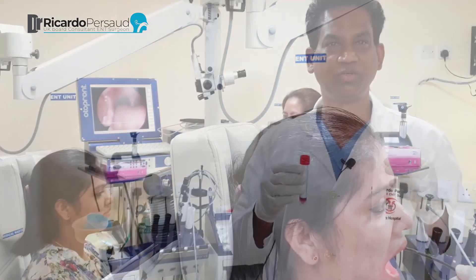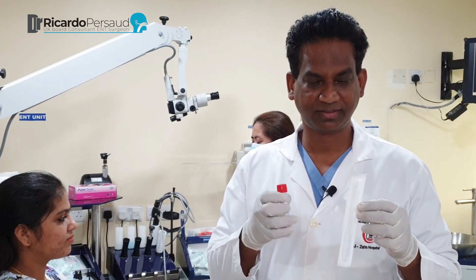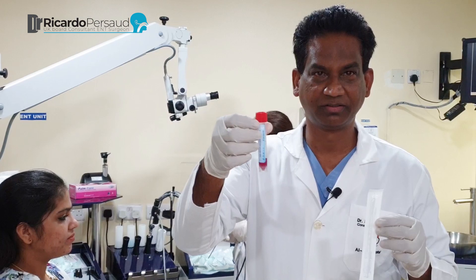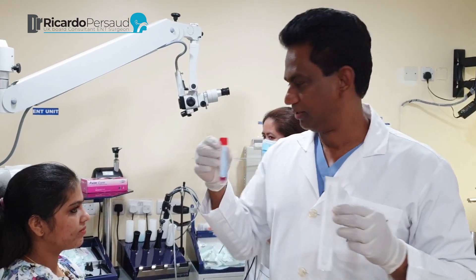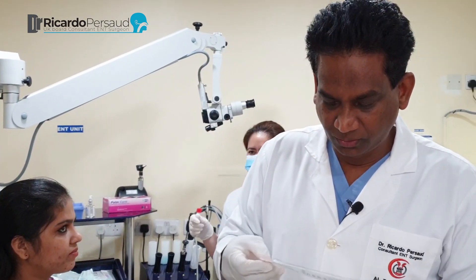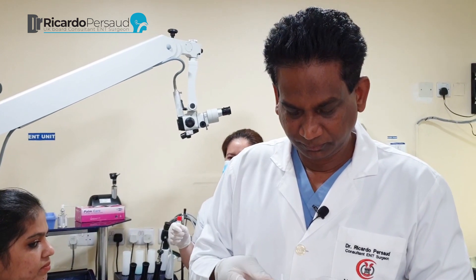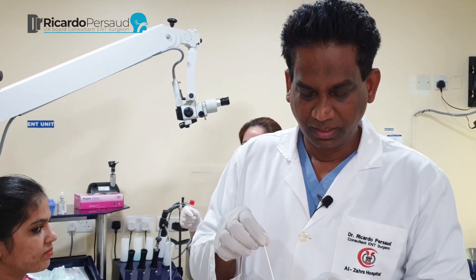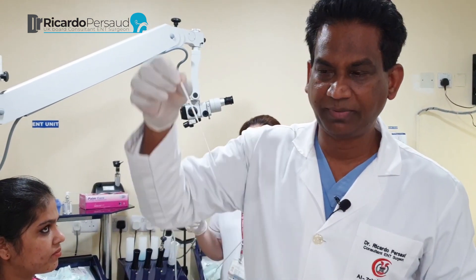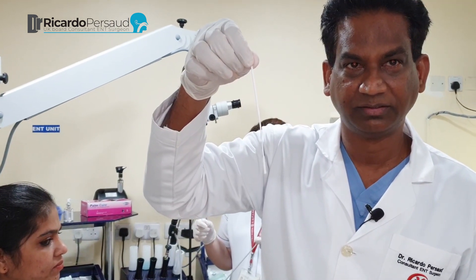This is the equipment for the COVID swab test. This is the swab and this is the reagent. So you open the swab like so — there's a cotton tip at the end. You don't touch that.